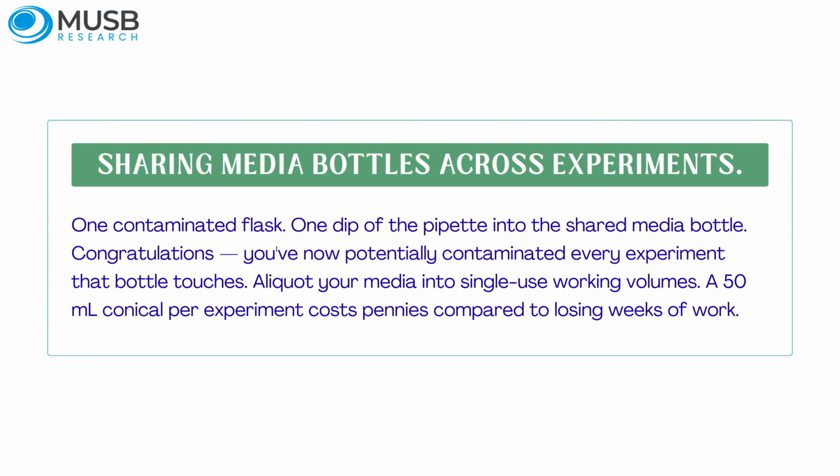2. Sharing media bottles across experiments. 1 contaminated flask, 1 dip of the pipette into the shared media bottle. Congratulations, you've now potentially contaminated every experiment that bottle touches. Aliquot your media into single-use working volumes. A 50 milliliter conical per experiment costs pennies compared to losing weeks of work.